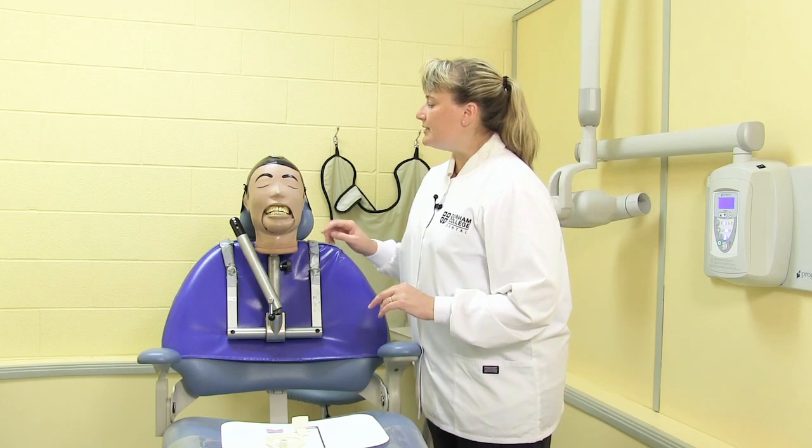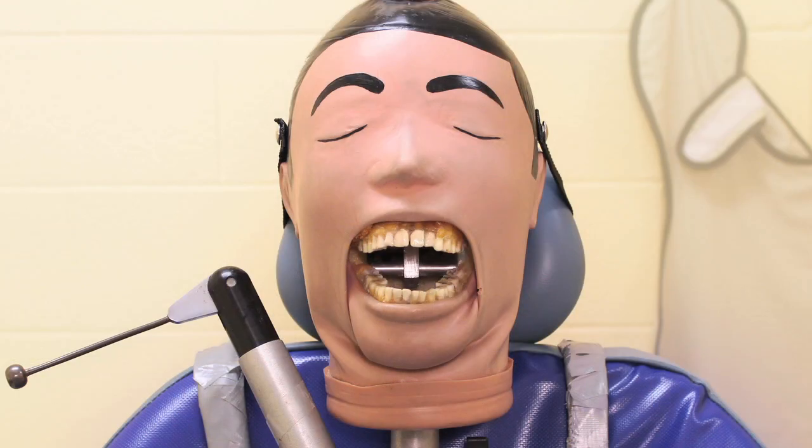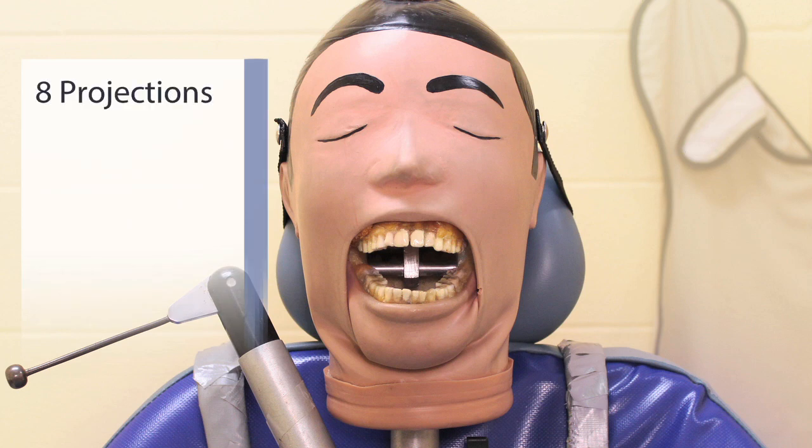I'm going to take, or we would take, 8 shots for the posterior with the paralleling technique. We would take a premolar view and a molar view for each quadrant. I'll demonstrate the left side for the client.